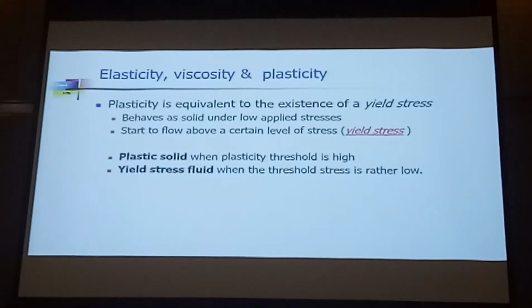That brings us to viscoelastic. And that is defined, the most important physical property in OVD is plasticity. That is when, under pressure, especially how fast you apply the pressure, the substance changes its physical behavior. The threshold is defined as yield stress. It becomes more fluid, like plasticity indicates how fluid it is.